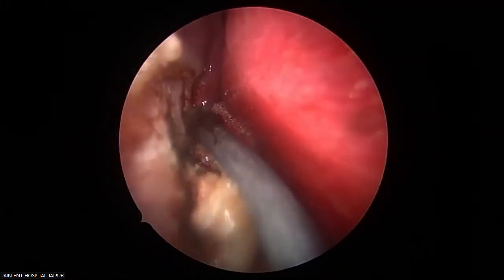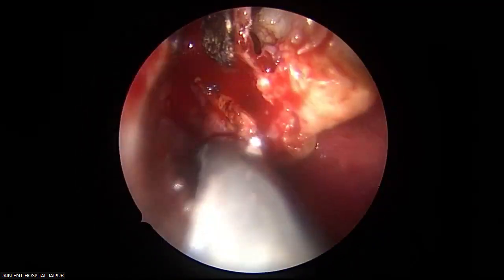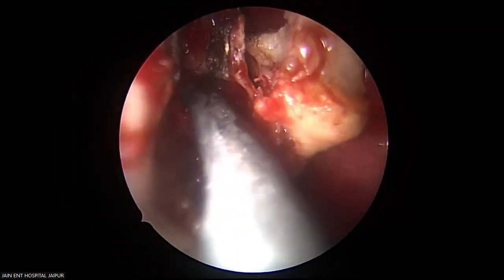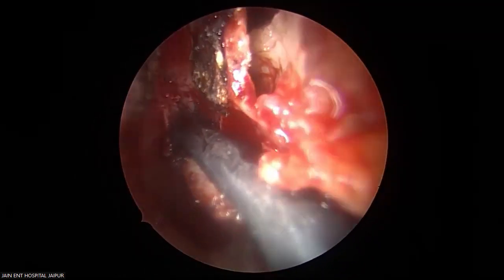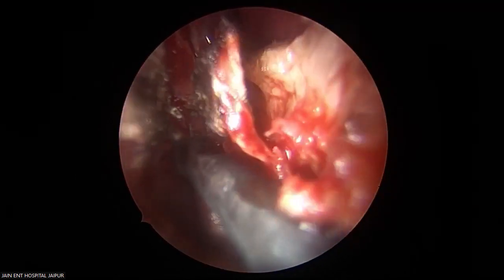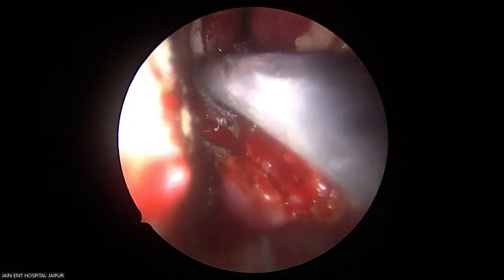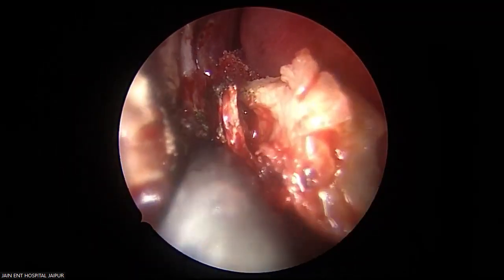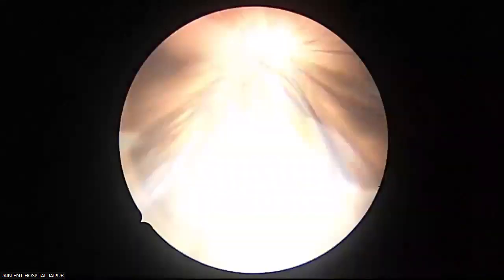Any bleeder coming from within the bone, you can apply your suction cautery rather than using the coblator. Wherever the bleeding is coming from the bone, be careful not to use your coblator. Now the field is good.